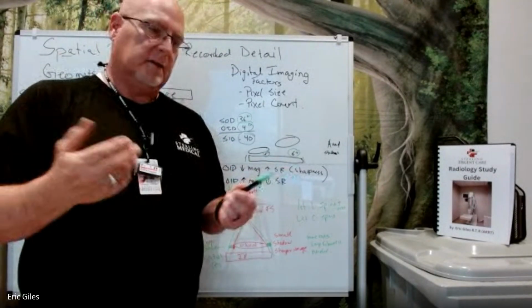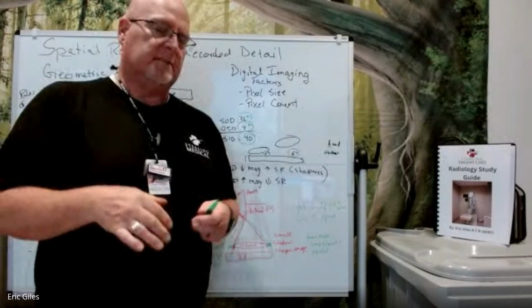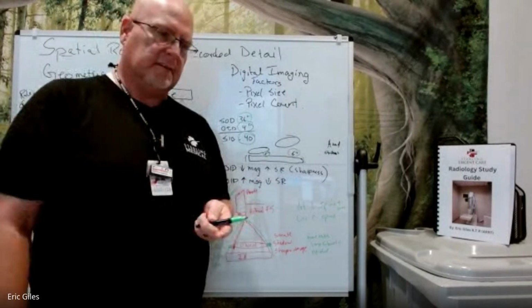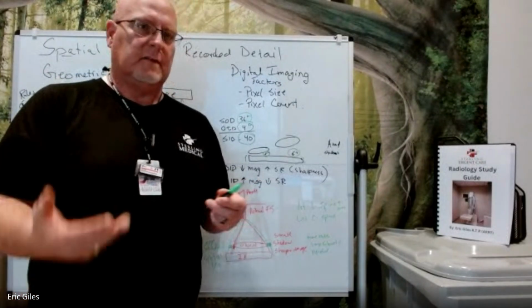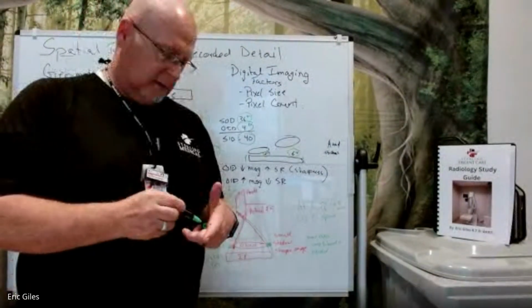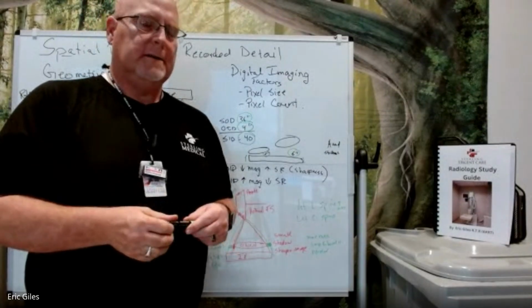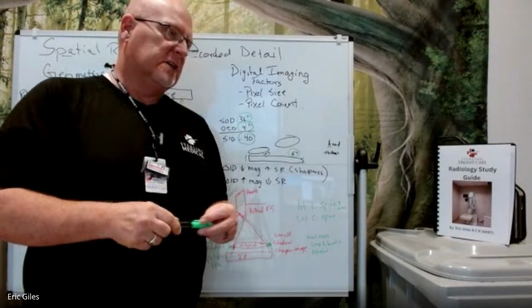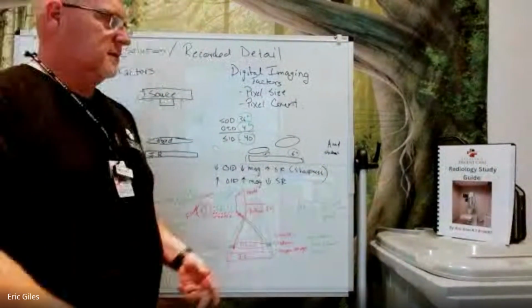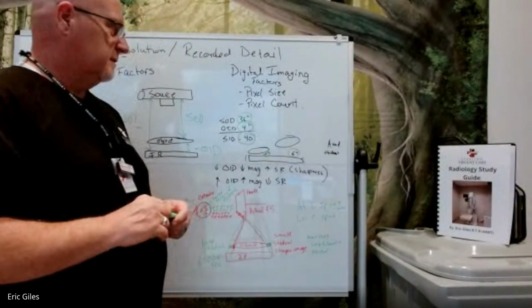The lumbar spine and T-spine, we're shooting those at 40 inches. There are some places that I've worked that will kick that up to 60 inches. We don't have the capability in most of our clinics. There are a couple with the newer machines that can increase their SID distance, make those images a little bit better. But keep that in mind. There's certain body parts where OID is unavoidable. You just need to do the best that you can.